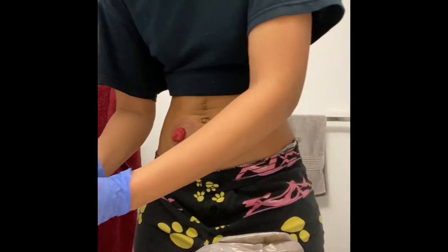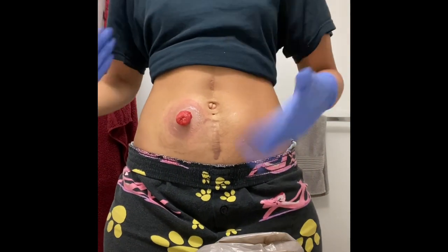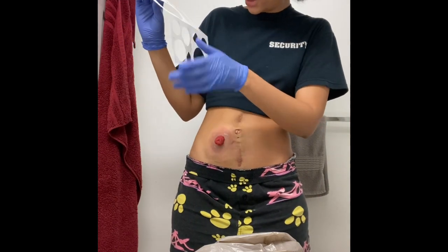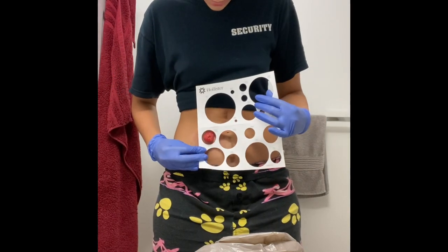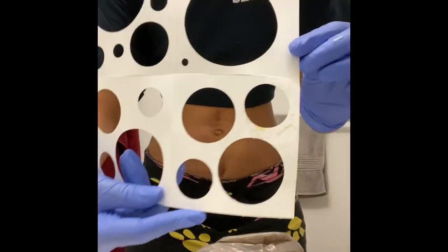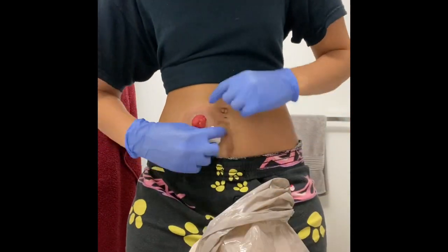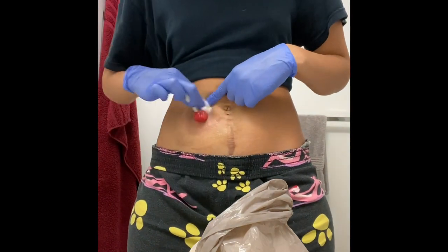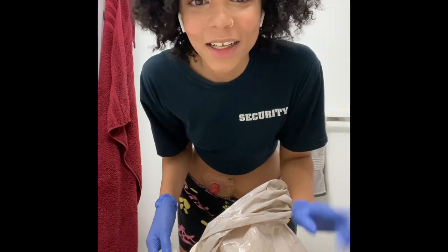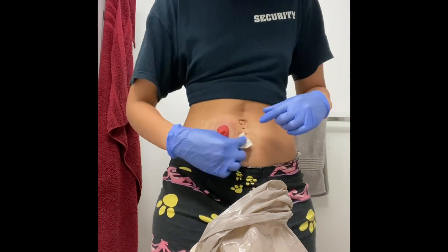I'm going to show you the stoma adhesive powder and zinc oxide I use to help with skin irritation. Now I'm going to show you how to measure your stoma — I'm looking to ensure I have the correct size, which is 35mm, and it looks about right with enough room around it. I'm also going to show you how much adhesive residue is still there even after cleaning so many times. I'm going over it again with soap and water to try to get all the adhesive off.